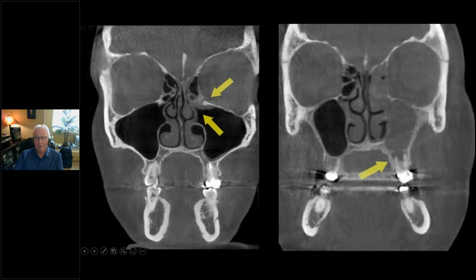Here's a tooth that's going to come out. You're going to plan the implants, got big lesions, got all this sinus change. I wouldn't touch this with an implant, ever. Okay, here are the reasons why. If you look at the lateral walls of the sinus, you can see these are much thicker on here. This says that this change has been going on for a long time.